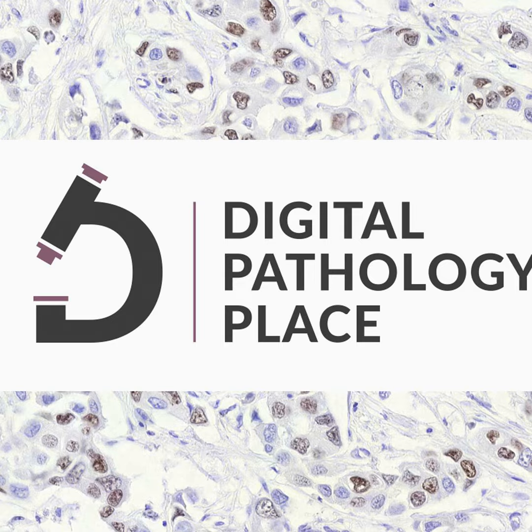So the point I'm trying to get at now is that pathologists can use these systems for primary diagnosis confidently, but there really isn't a great number of choices for algorithms. The vast majority of algorithms used in the United States are research use only, which means the quality is variable, and the lab's pretty much on their own to validate.